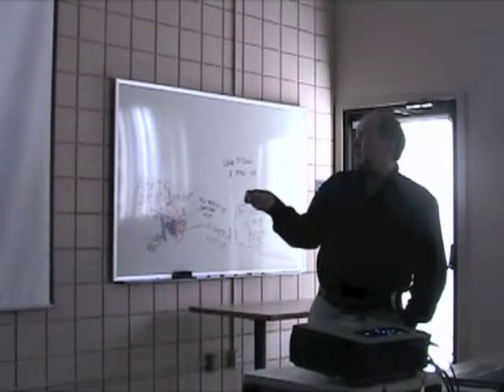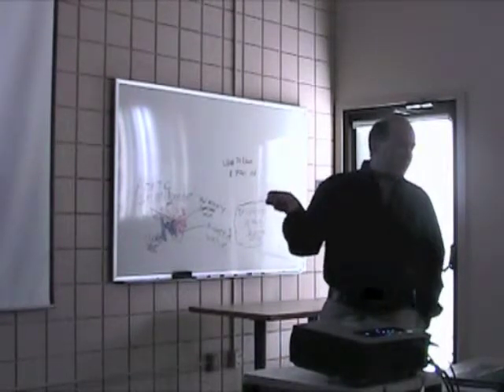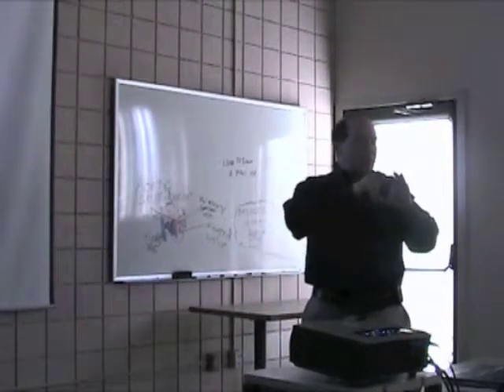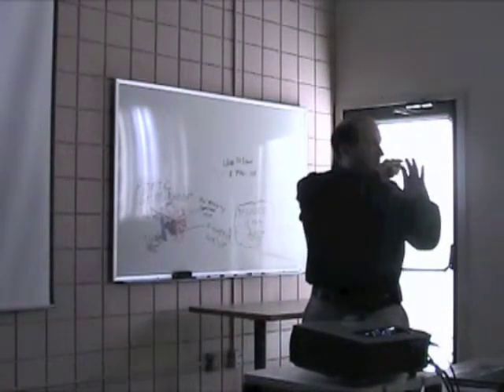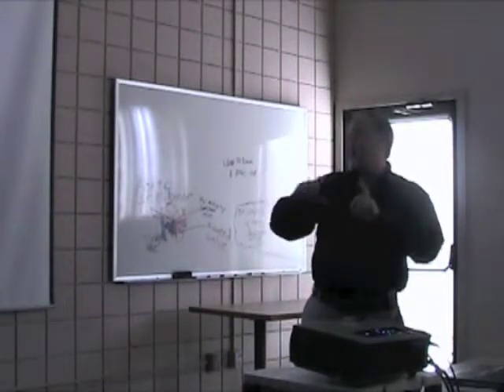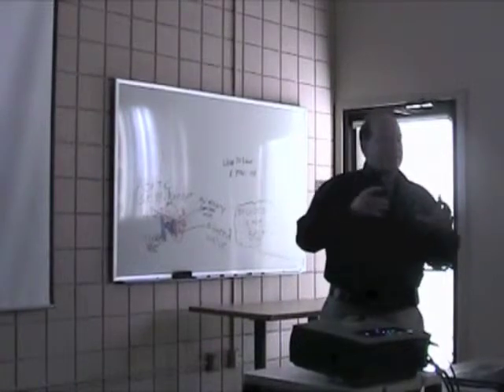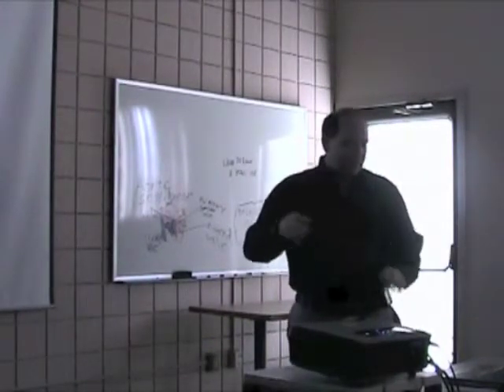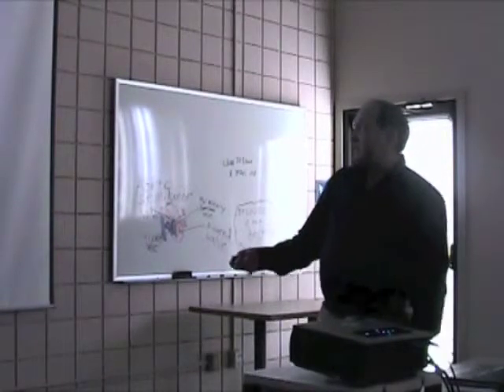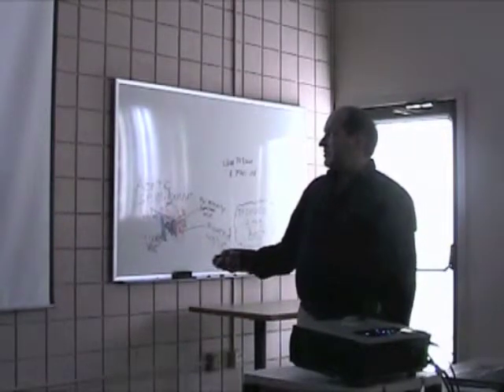This stentless valve can improve the blood flow through there, the hemodynamics through there, because all the other valves you saw had a piece of cloth and some metal on there that take up some of the space that blood can be flowing through. Stentless valves don't have those stents on there, and as a result they have improved blood flow, improved hemodynamics through them. That's the advantage. The disadvantage is it's additional training required.